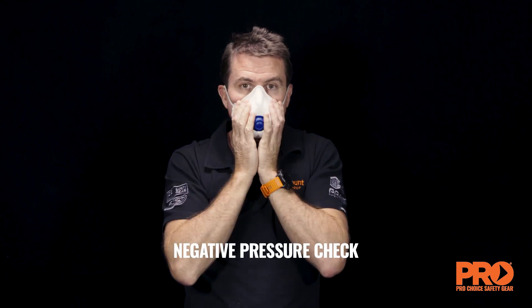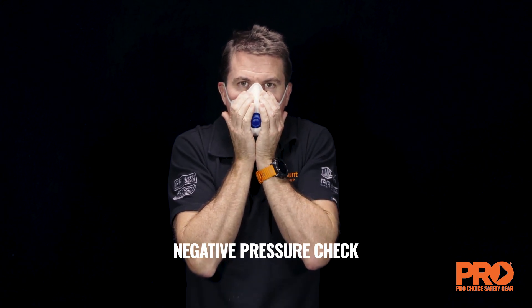The negative pressure check involves covering the filters and inhaling. If any air comes into the mask, adjust and repeat until you have an adequate seal. This will be noticed by the mask gently collapsing on the face.